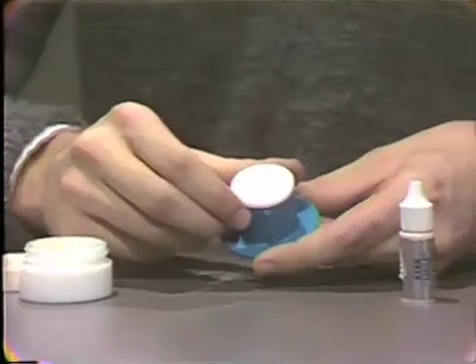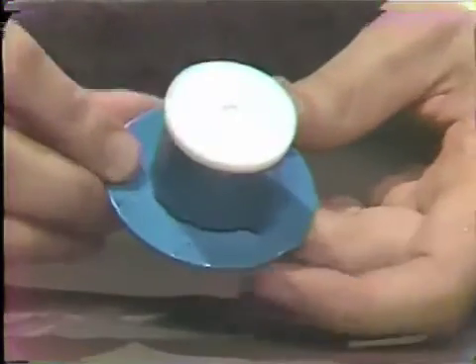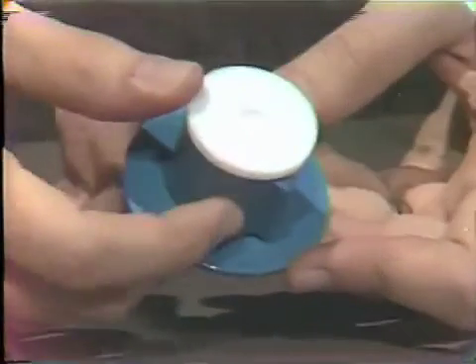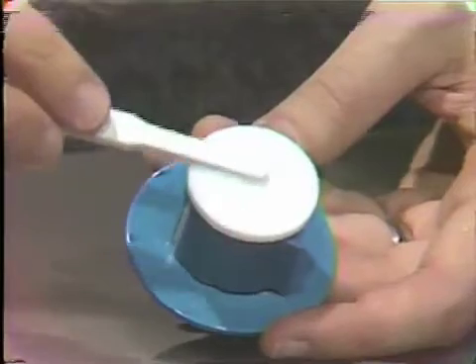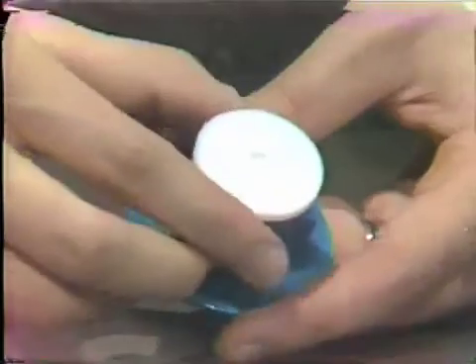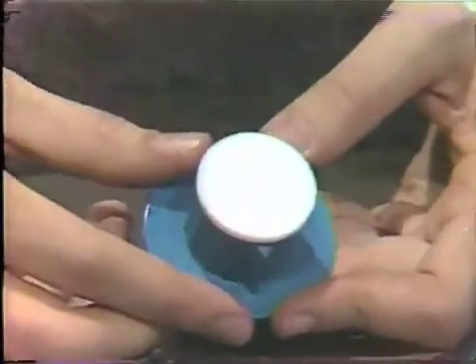To dispense the paste, the Smilometer is grasped firmly in one hand, with the other hand rotating the cylinder toward the position to be dispensed. Then the cylinder is pressed down firmly to ensure it is seated properly. The paste is then pressed into the depression and leveled off. Once this has been done, the cylinder is rotated to the mix position and pressed down firmly to give the mixing surface.